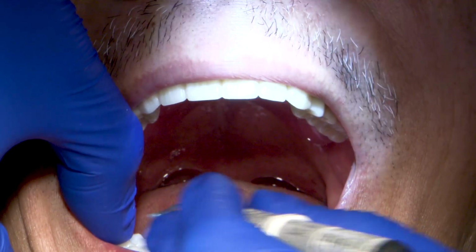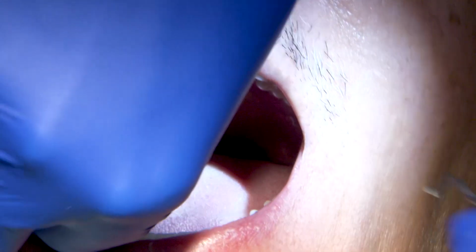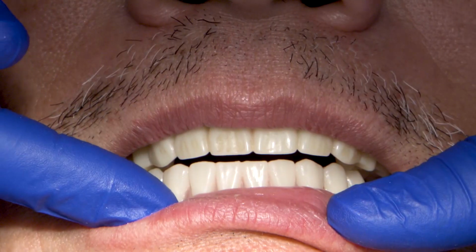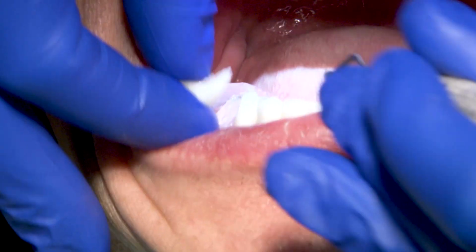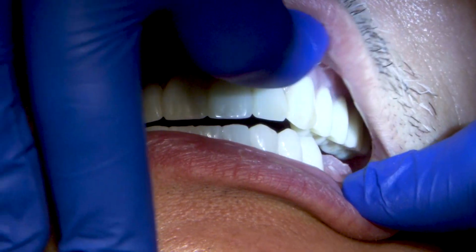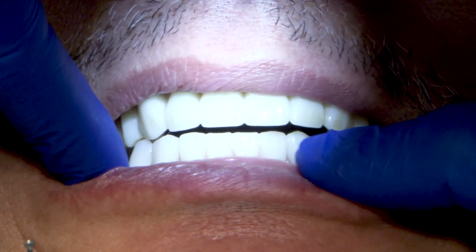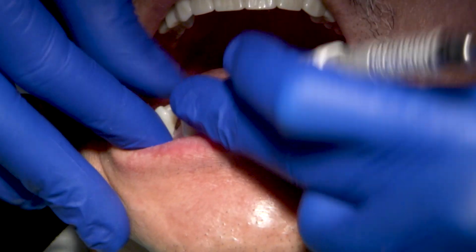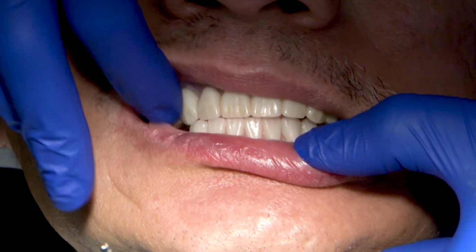Leaving the setup in place, I am going to simply remove the posterior teeth that are causing an interference. Here you can see that I pop the teeth off one at a time, assessing the bite and vertical dimension as I go. In this instance, I wind up popping off all the posterior teeth and slightly moving the anterior teeth into a better position in relation to CR. Remember, the teeth are in wax at this point, so feel free to move the remaining teeth around on your own to ensure the bite and the vertical dimension is correct.